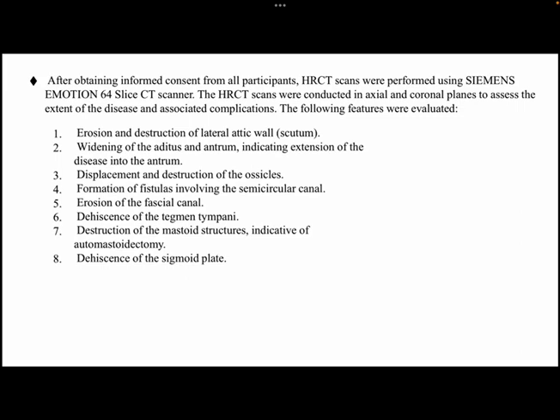After obtaining informed consent from all participants, HRCT scans were performed using a Siemens Emotion 64 slice CT scanner. The scans were conducted in axial and coronal planes to assess the extent of the disease and associated complications. The following features were evaluated: erosion and destruction of the lateral attic wall, that is scutum, widening of the aditus and antrum indicating extension of the disease into the antrum, displacement and destruction of the ossicles, formation of fistulas involving the semicircular canal, erosion of the facial canal, dehiscence of the tegmen tympani, destruction of the mastoid structures indicative of auto-mastoidectomy, and dehiscence of the sigmoid plate.